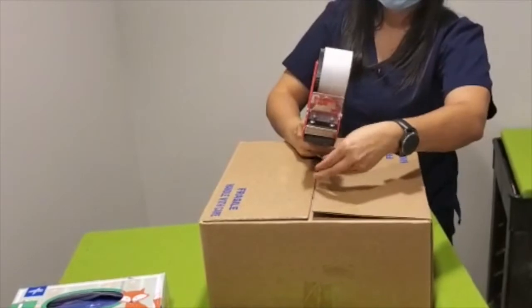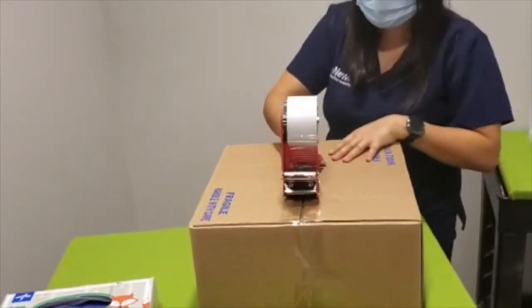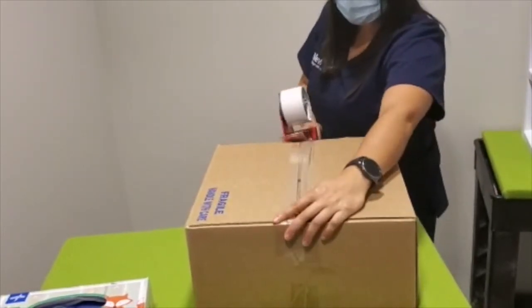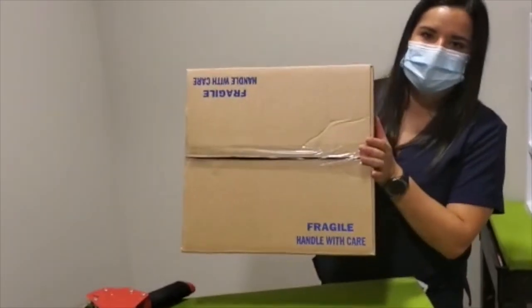Make sure that this goes back to Innovative Health in Arizona. Remember to put this in the designated shipping area.